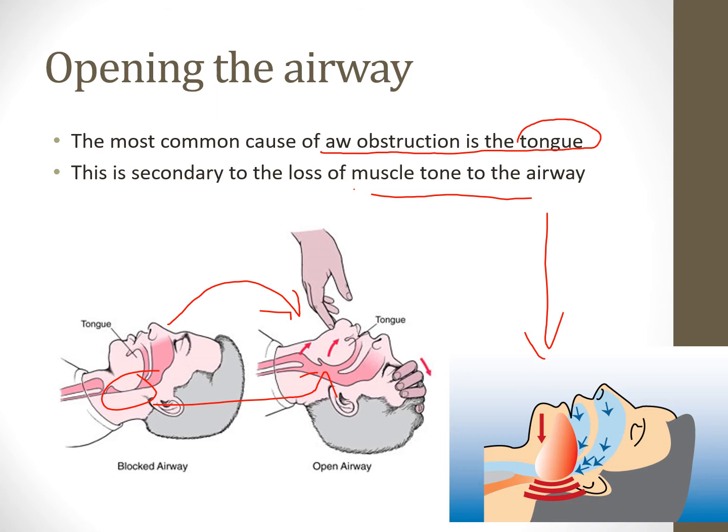And sometimes if you open that airway up and start hand ventilating them, you might see some of these patients actually start to come around, because their issue was something readily fixable, but their CO2 levels got a little too high. Right? So do whatever you can to get the tongue from the back part of the airway, and we need to be aware of different circumstances, like, do we use positive pressure if their stomach's full? Do we use a nasopharyngeal airway, right, to get the tongue out of the way?